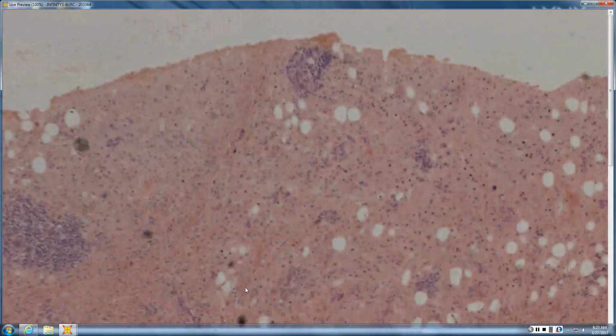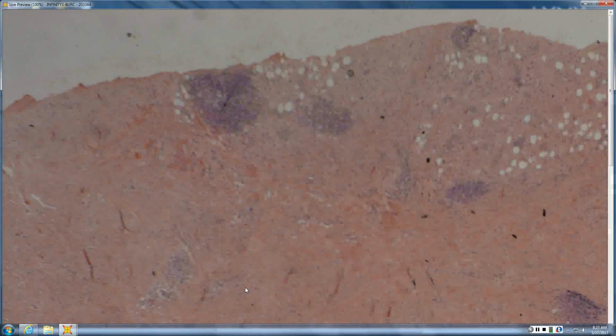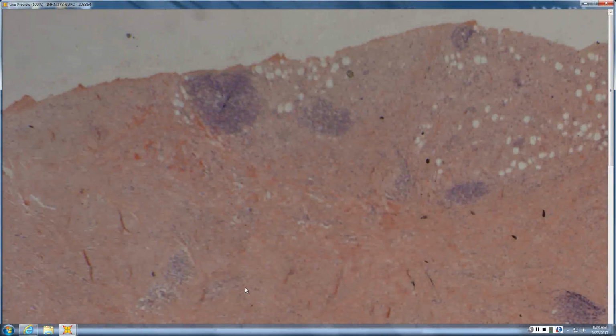Okay. Does the body like this thing? No. So when you have something that is producing collagen and has lymphoid aggregates, what's the first thing you think of? Like a desmoplastic melanoma, absolutely.